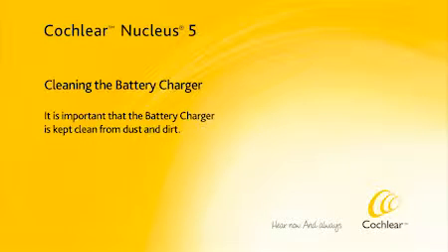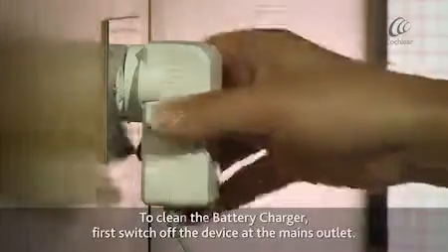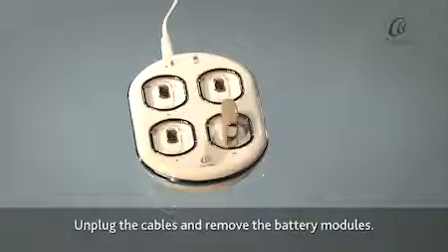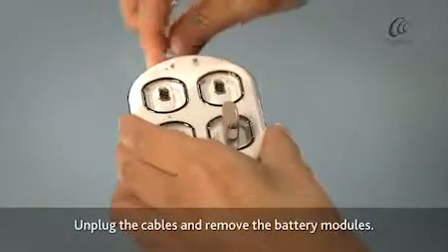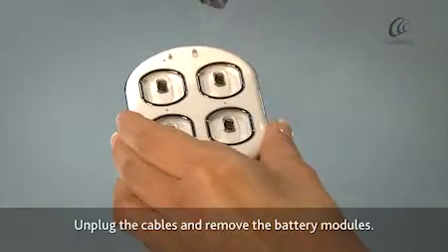It is important that the battery charger is kept clean from dust and dirt. To clean the battery charger, first switch off the device at the mains outlet. Unplug the cables and remove the battery modules.